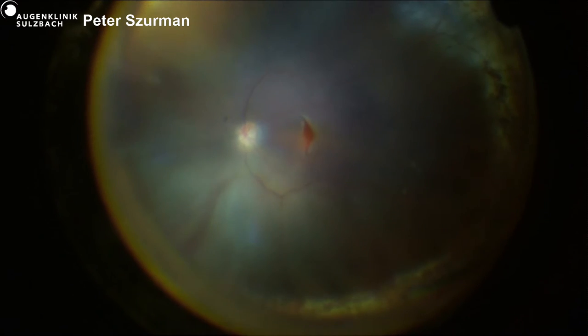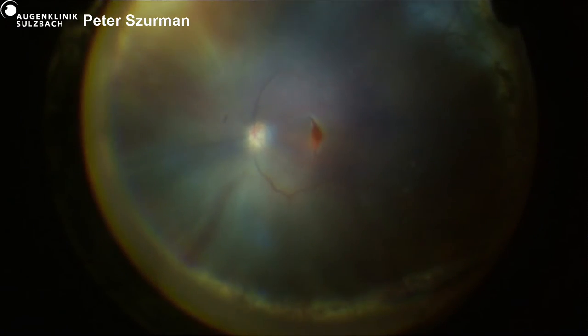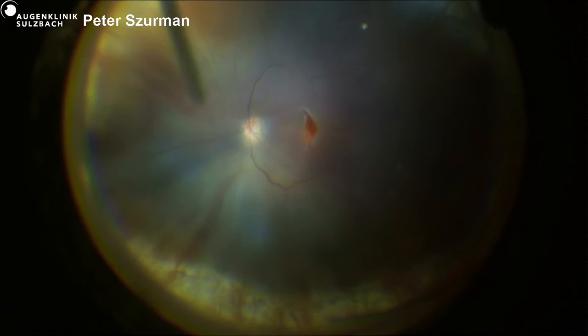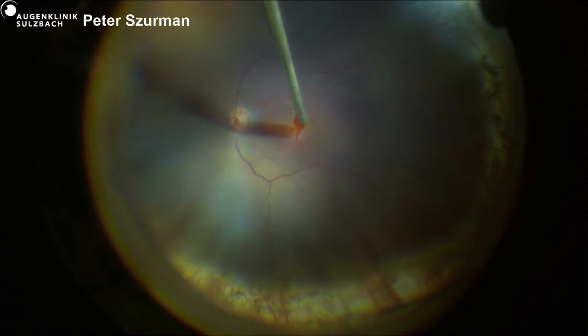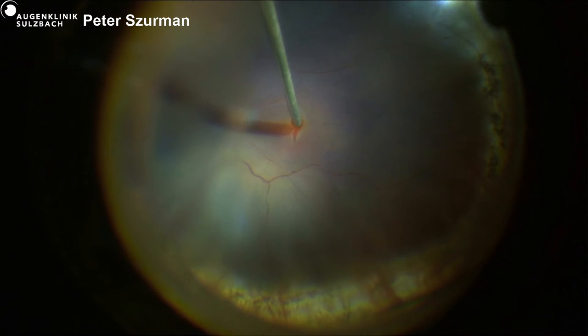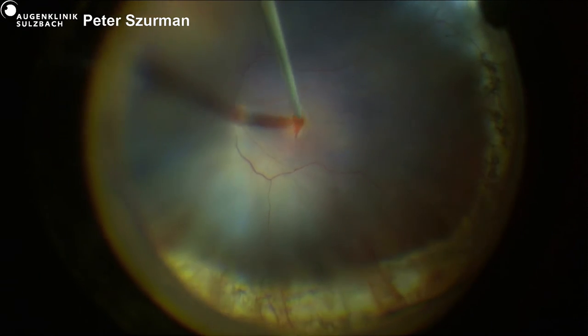What kind of? 27 or? No, instrumentation. What gauge? It's 23. In difficult cases, our standard is 23. If you use for the suction of the subretinal fluid a 27 gauge cannula? This is a normal fluid cannula.